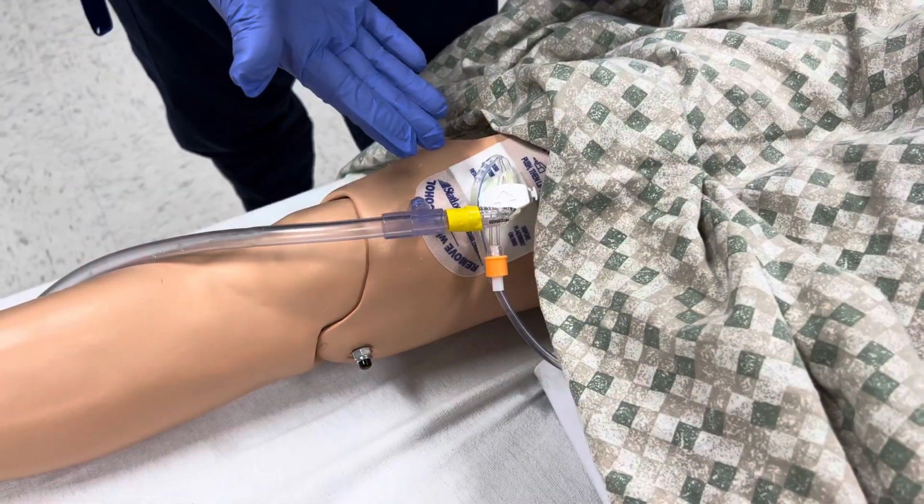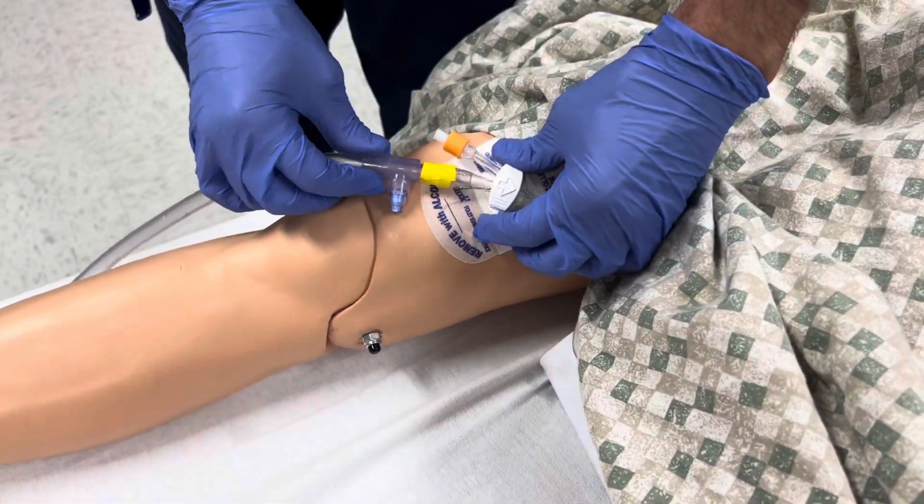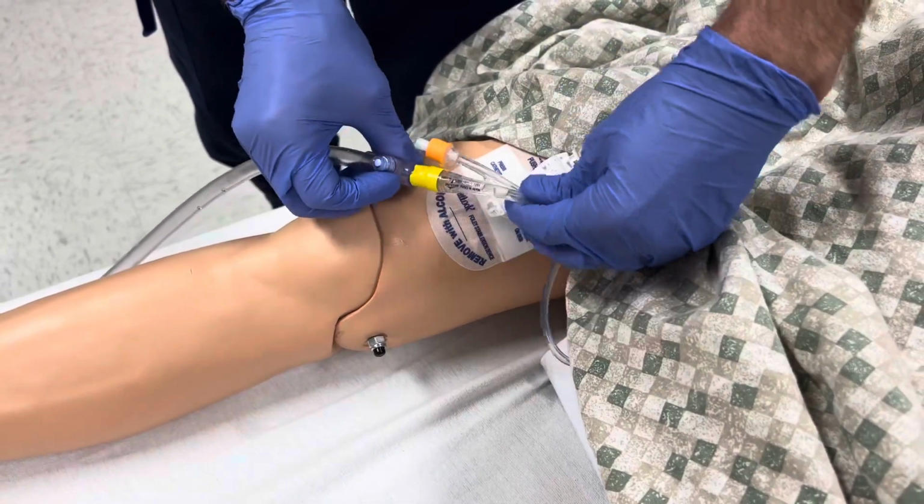The side of the stat lock is probably the most common location for kinking due to tension or twisting at the site, so release the catheter from the stat lock and then replace it correctly.